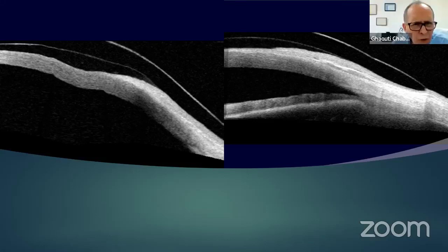Sorry, Ed. Do you mean that you don't use any more fluorescein and slit lamp? I do fluorescein and slit lamp to make sure the edges are valid, but not to determine the fit. It's all done with OCT. So you think that OCT will be a gold standard for sclerals in the future? Absolutely. There are several companies out there.